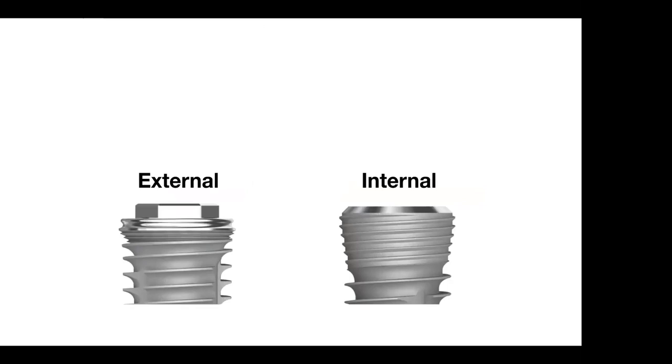Let me talk about the difference between external and internal connection a little bit. I'm pretty sure not many of us are still using external connection these days.